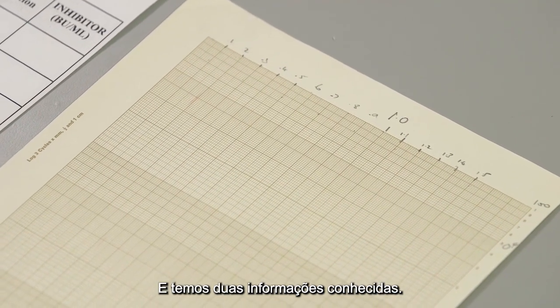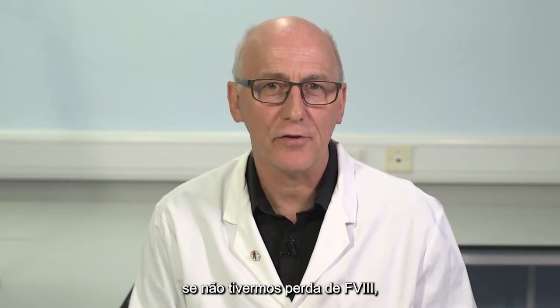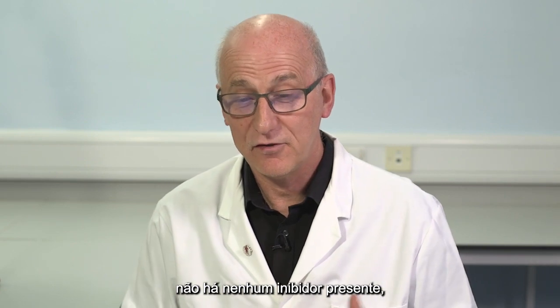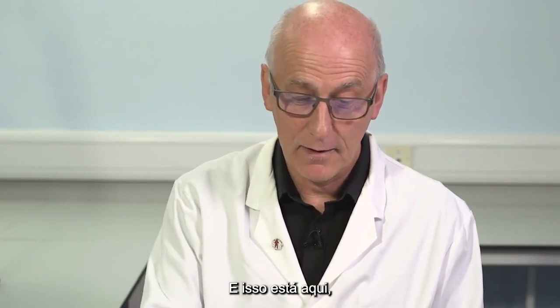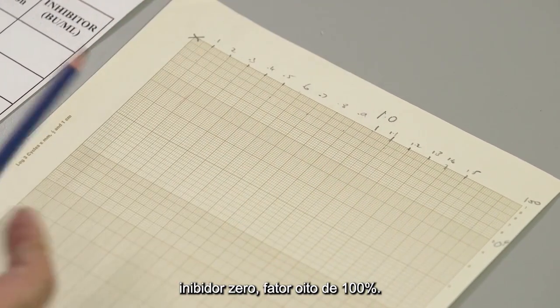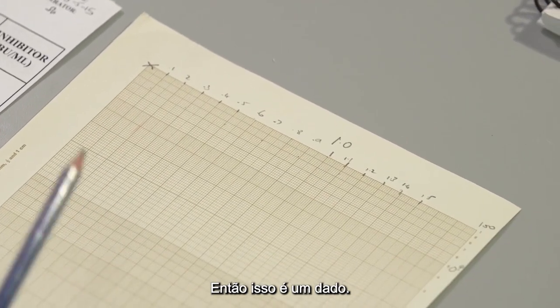And we have two known pieces of information. The first one, if we have no loss of factor 8, 100% residual, there is no inhibitor present. Zero inhibitor, 100% residual factor 8. And that's here. So this is a given.